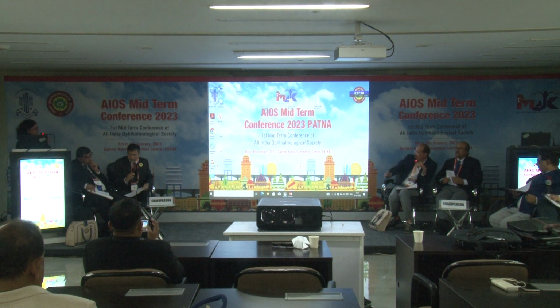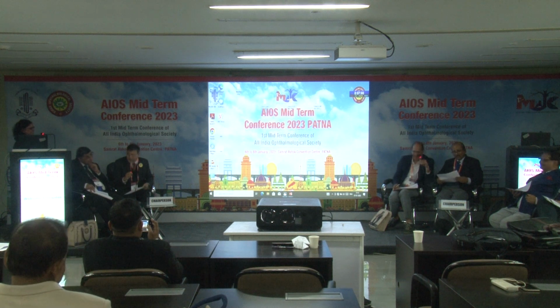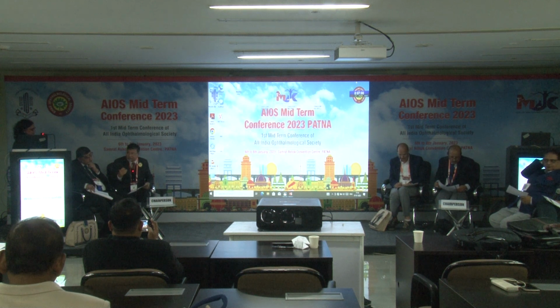So how do you ensure that you get that? It goes, sir. Suppose you have not been able to negotiate the Fox pentagon, and your needle has been extracted somewhere else. Because it is malleable, yes, sir. In that scenario, what would you do? Would you do the re-surgery on the same day, because you can have profuse bleeding, or will you defer the surgery for a week or two?